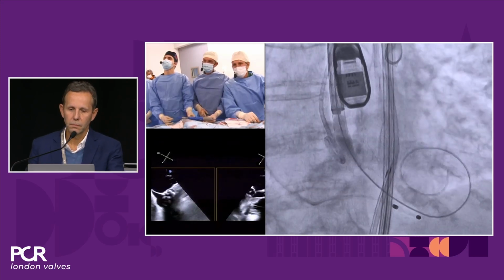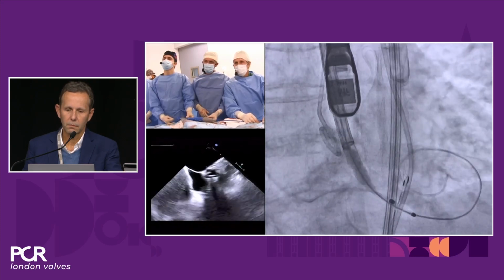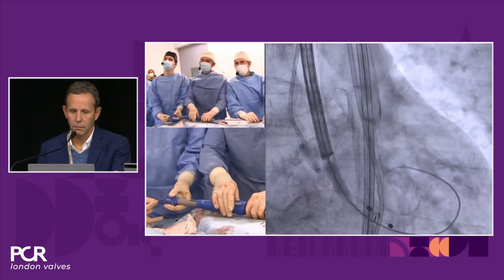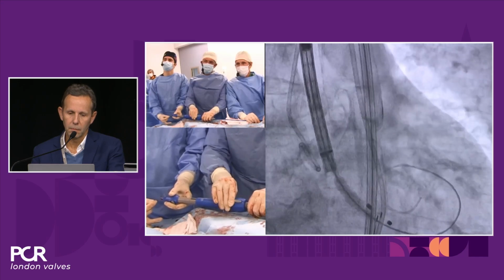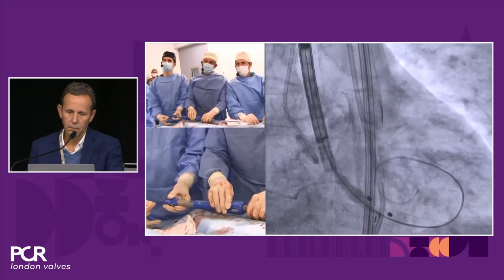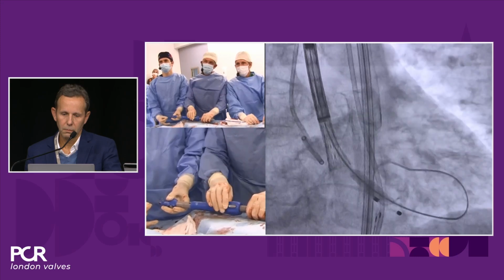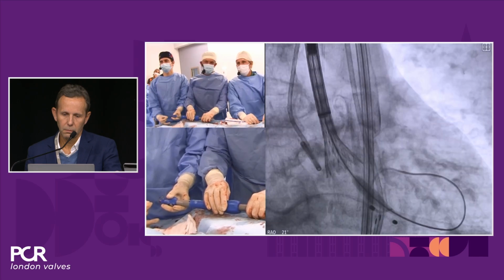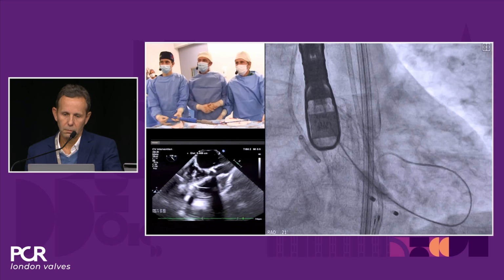You're inserting the valve. Still a little resistance, right? Yes. So in the cusp overlap position, we start deploying the valve, aiming for 3 to 5. We are very good. Yeah. Now, Marcelo, if you want to see the echo. We can go all the way, and we check by echo. Okay. So Marcelo shares with us how deep we are.